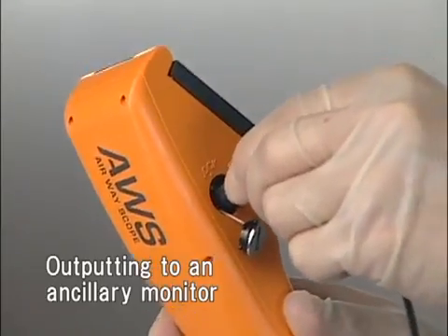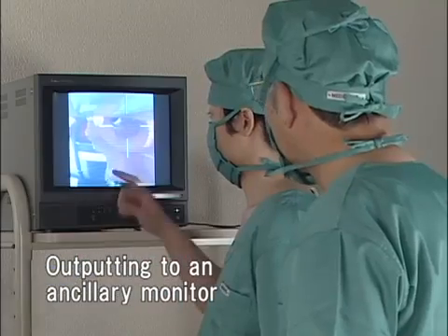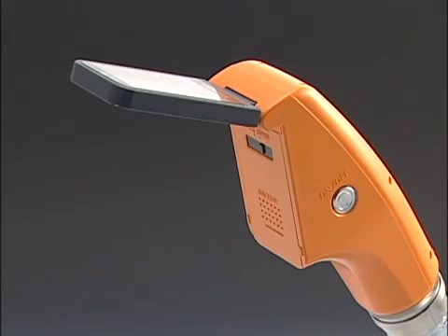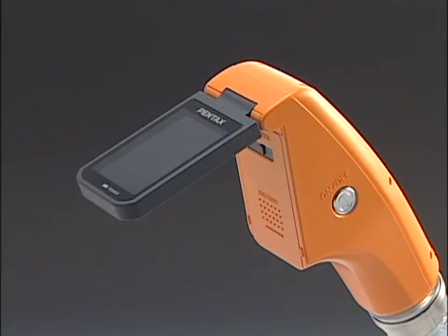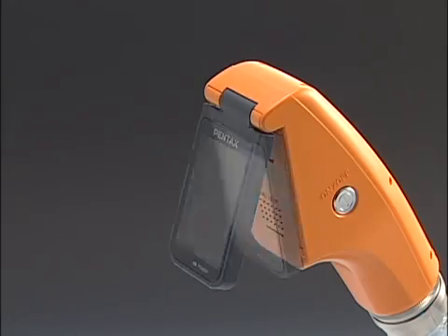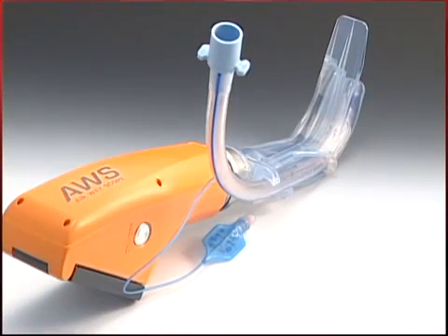Even more people can observe the intubation by outputting the images to an ancillary monitor. The monitoring screen can be adjusted for easier viewing and you can conduct tracheal intubation on a patient in any posture. Now watch how Pentax AWS can be used in a variety of positions.